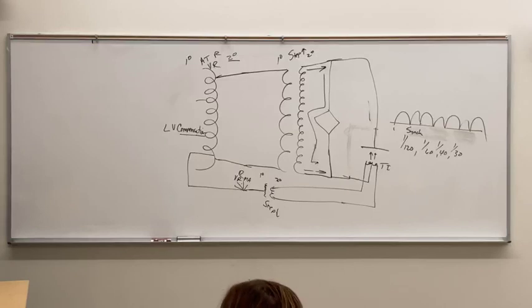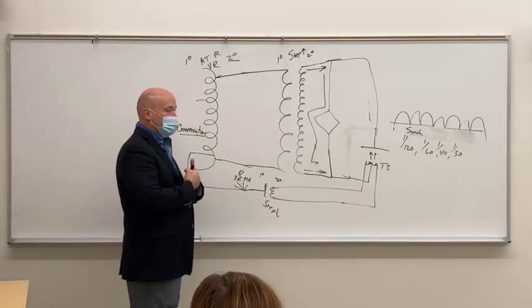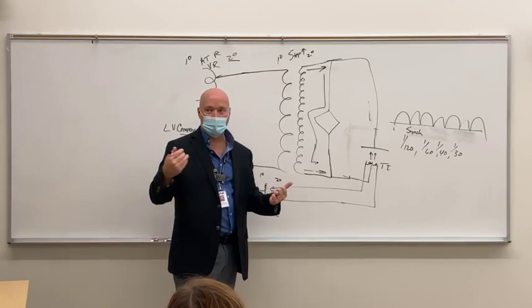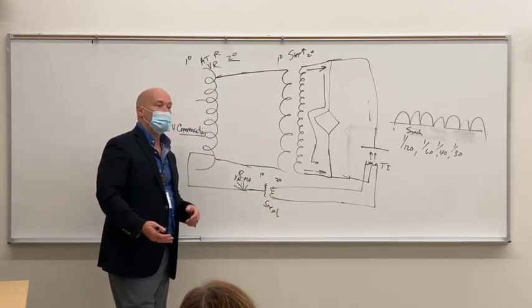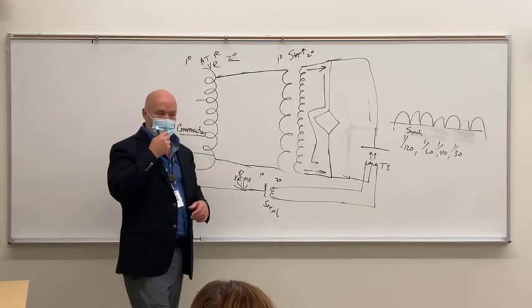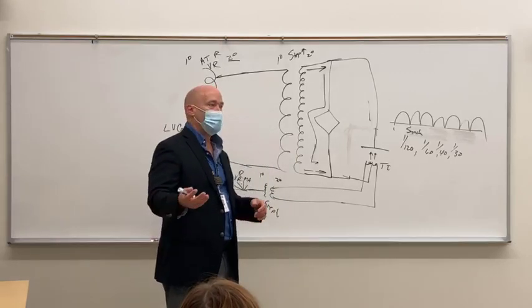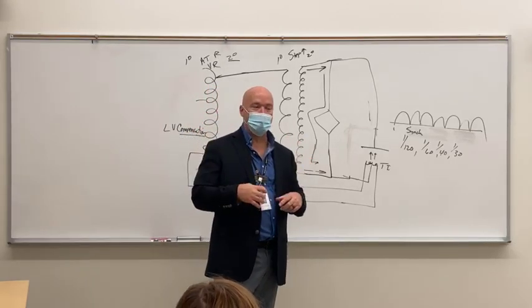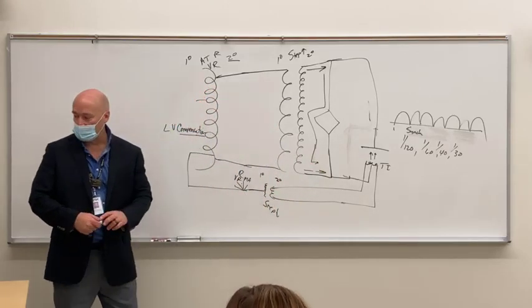Any questions on, well, we did talk about the rectifiers themselves, where we have a solid state diode. We've got two silicon pieces joined together, one with N-type, one with P-type. Characteristics of the N-type were that they were negative, which means that they have an excess of electrons, right? The characteristic of the P-type was that it was positive. It had electron holes, which means it has an absence of electrons. Same answer, right?